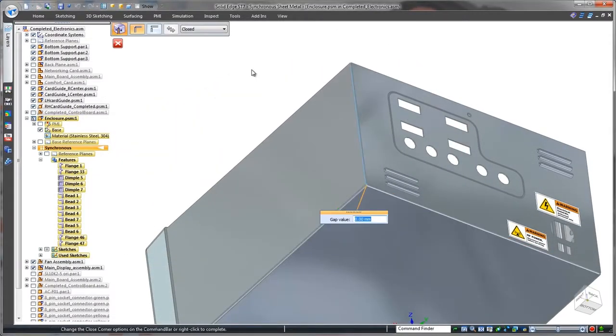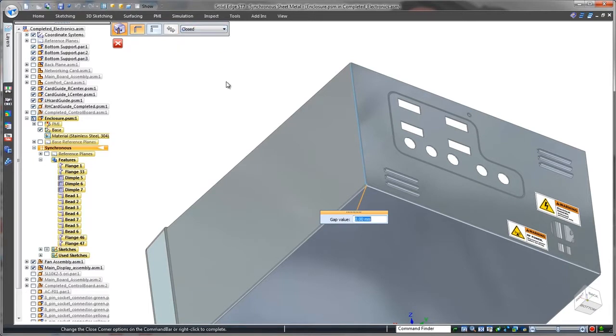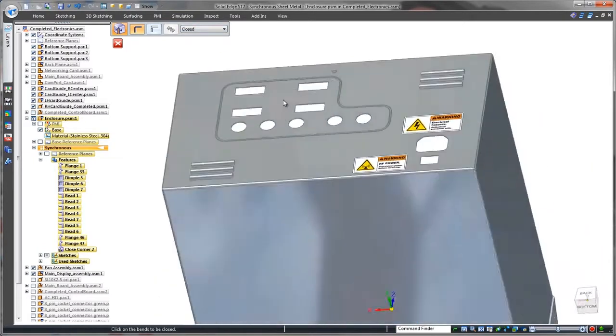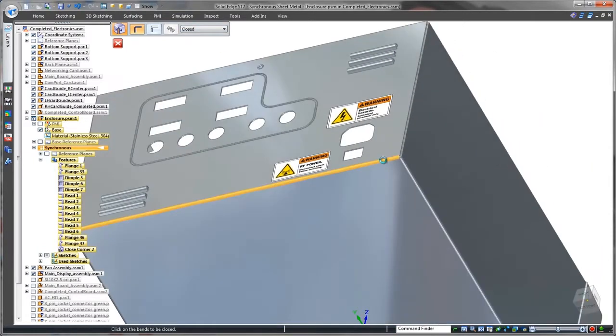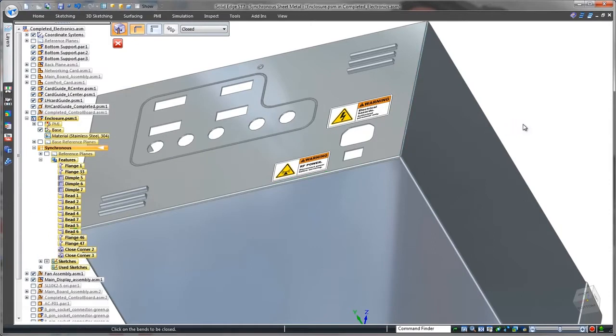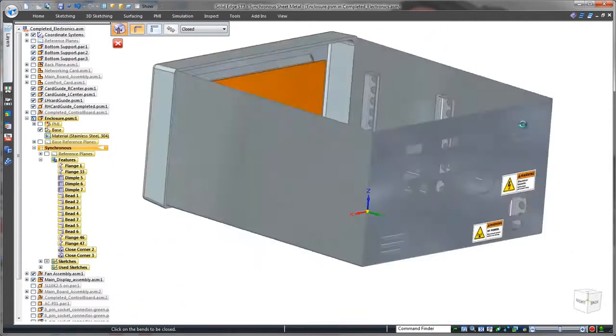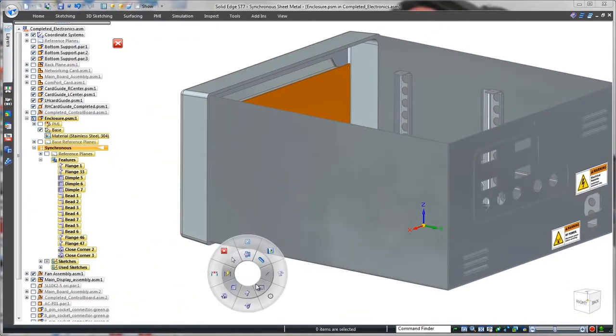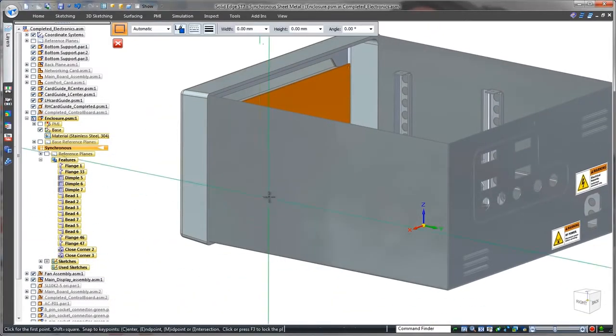Medical device manufacturers must adhere to strict government regulations, and any gaps between panels could be faulted. Using the close corner command, these gaps are eliminated.